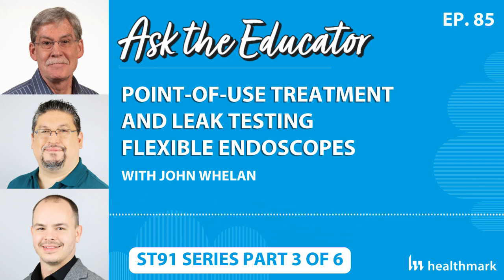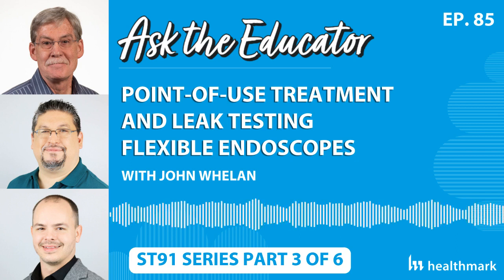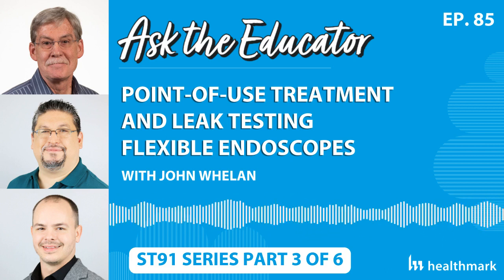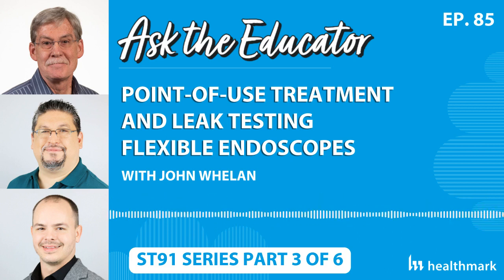It's an excellent point. And then when you get to the decontamination area, so we've done pretty much all the steps of the point of use treatment. And now we're getting into the sterile processing or into the endoscopy area where this flexible scope is going to be processed. There's a new step initially for the leak tester and testing specifically the leak tester output. Can you talk a little bit about what that new standard says and what we need to change based on what we have and what we've historically been doing, and then what the new standards are telling us?